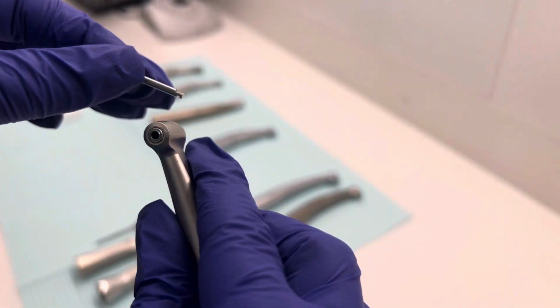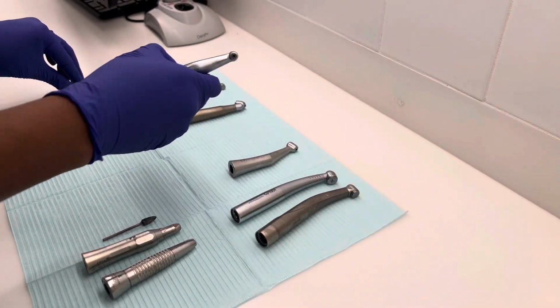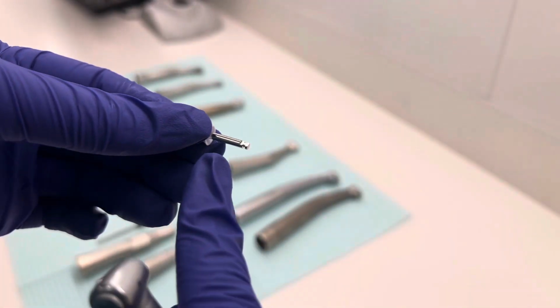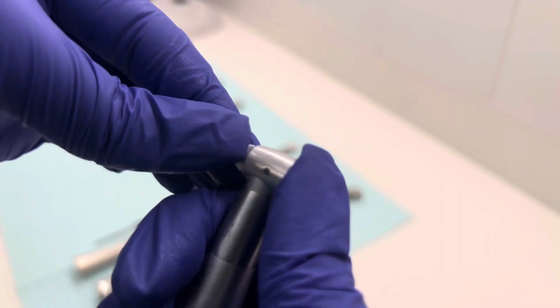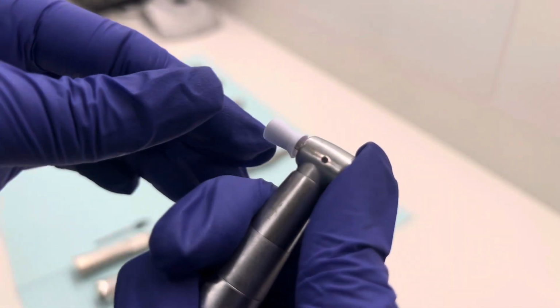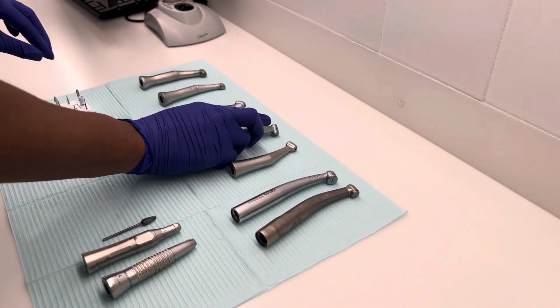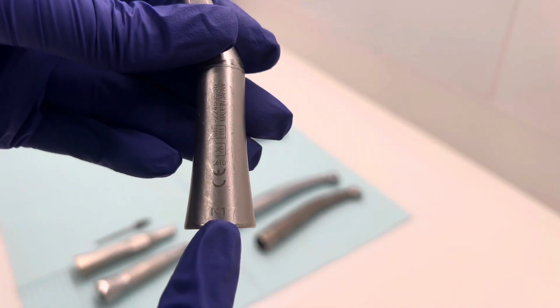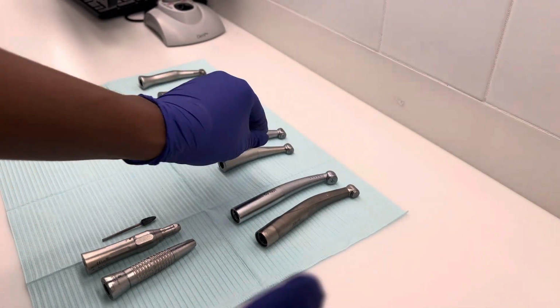But here I'm demonstrating how you can use a latch type burr to put it in. And I'm using a prophy cup. It also has a latch type at the end, and that's how you know that's probably for the slow speed. Put it in, make sure it's firm, easy to take out, easy to put in. Same thing, push it back and pull it out. It's as easy as that, just like the high speed. And yeah, there's usually digits on there, and they kind of let you know what the RPM is.